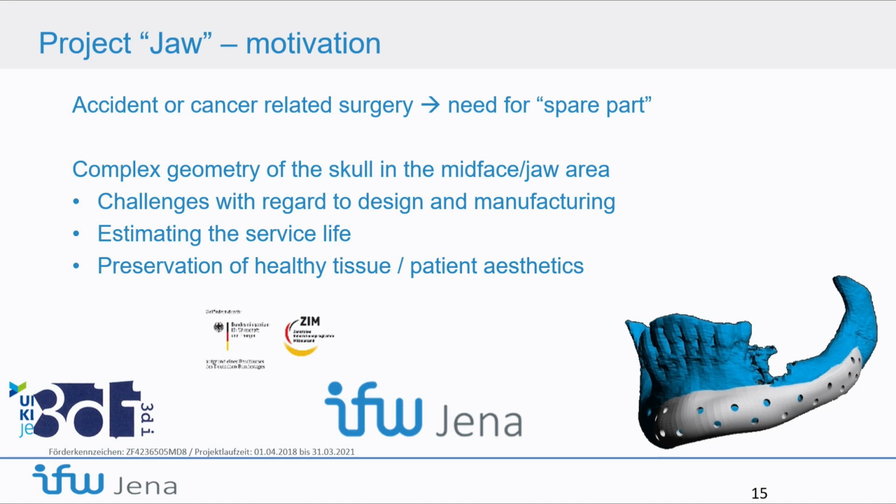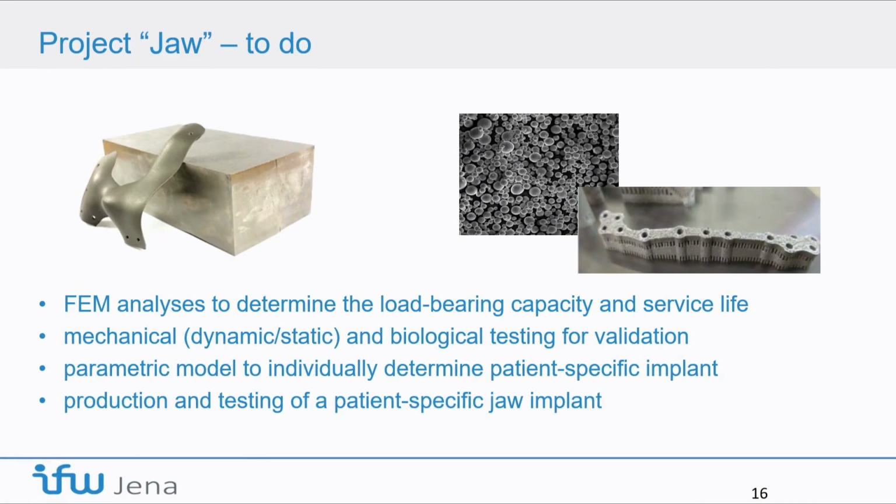That's too much. So we had this project, and the challenges we addressed were regarding the design and manufacturing, and also estimation or prediction of lifetime. You do not want to replace it after 3 years, get another bracket inside because it's broken. And this was the main topic of the project. It was done by the University Clinical Hospital of Jena, 3DI, a provider of implants, and we are the building and testing facility.